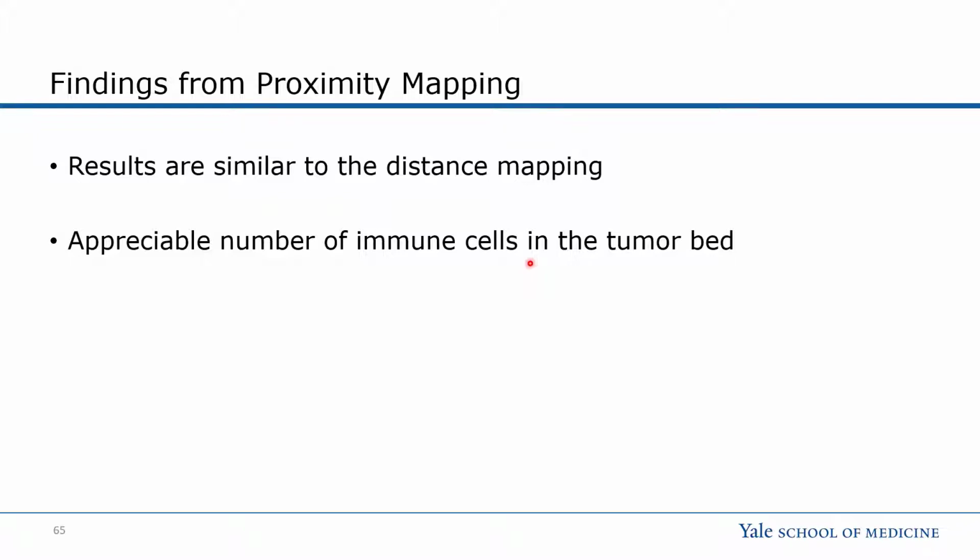And so paying a little bit more attention to those and trying to phenotype and map them out would be helpful to try to delineate some of the therapeutic responses, potentially the differences in therapeutic responses that we're seeing.